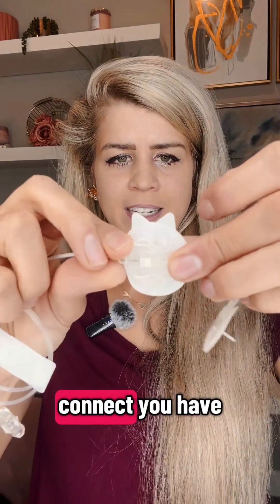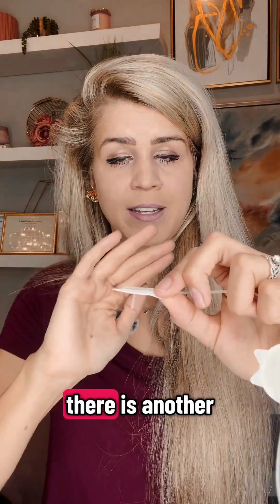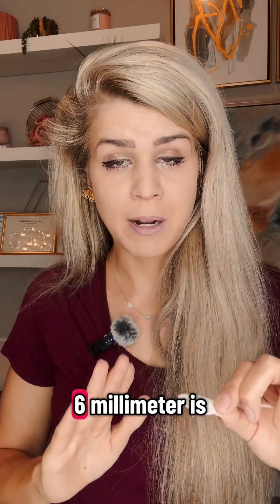So you would connect — you have the metal cannula. This is an eight millimeter, but there is another one that is six millimeters. The six millimeter is more popular.